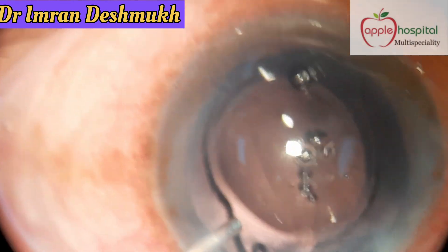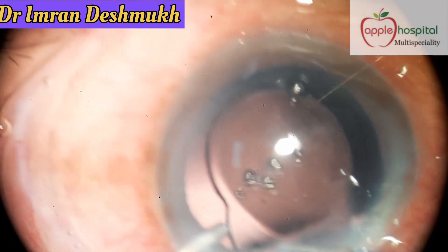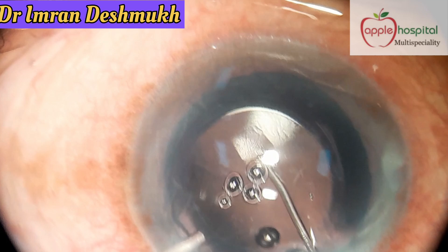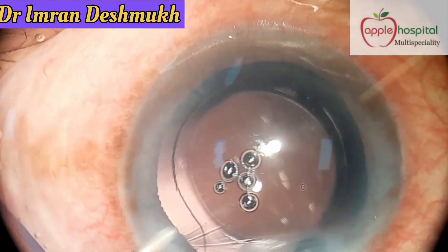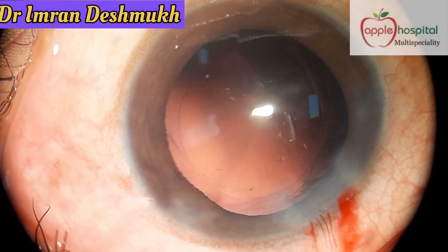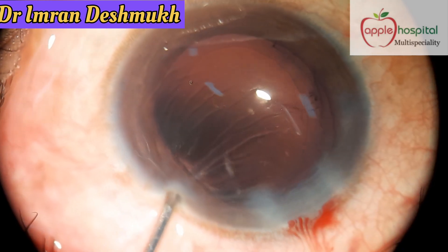The technique involves using the irrigation port of the bi-manual IA, or you can also use a disposable steel cannula attached to the irrigation port of the uni-manual IA. What I personally use is a disposable steel cannula attached to my irrigation port of the IA.